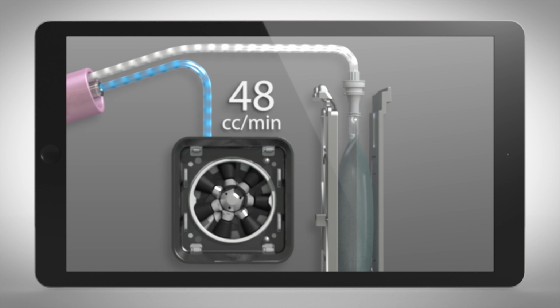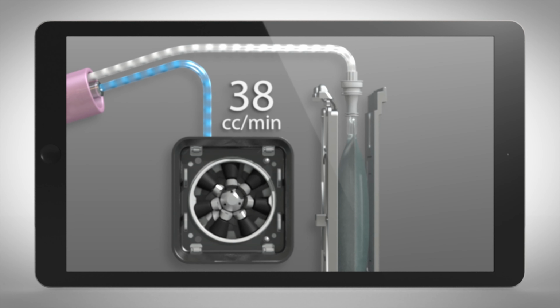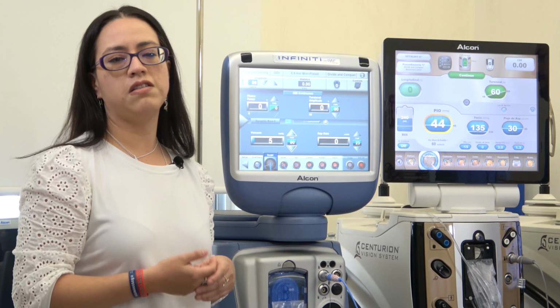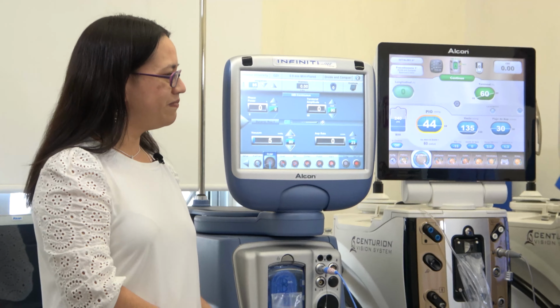Because you need to react to what's going on. Now it's the opposite. You will have a very stable anterior chamber, and the back is going to be squeezed inside the system. Excellent.